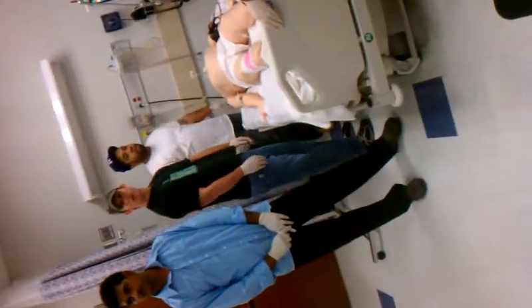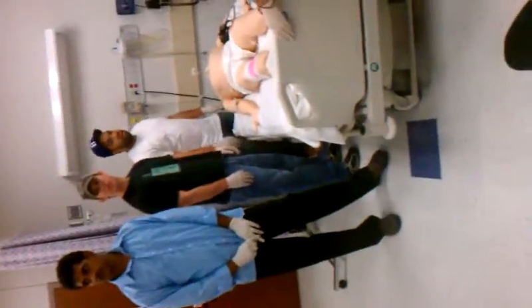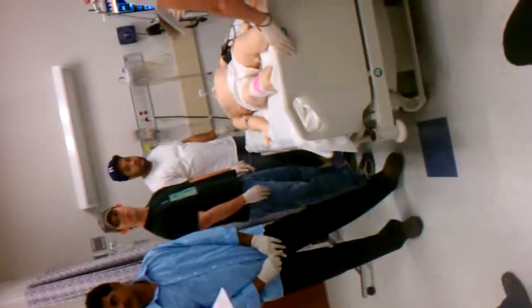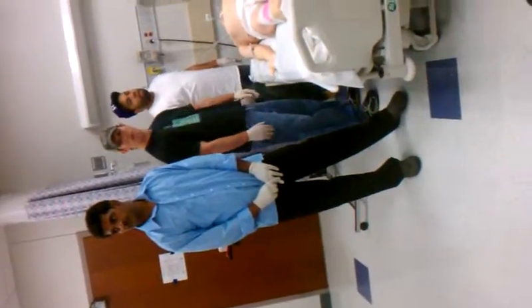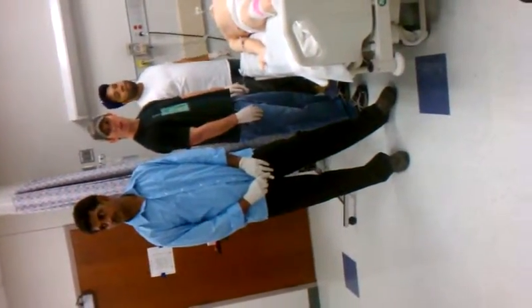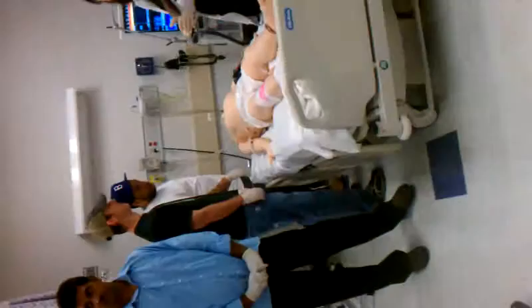Mini mask. Don't always think about what you're doing in the hospital, okay? What they want on here is a cool mist at 35%. Why do they want the cool mist? To soothe the throat. So that's why they're saying the cool mist. Okay, so let's extubate him.